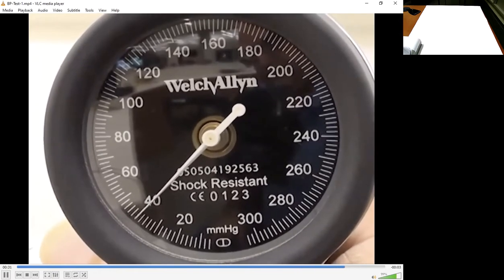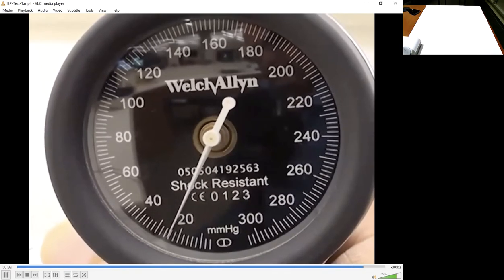All right, so you're going to self-grade yourself, but this is an important reflection. Were you close, within 2 millimeters of mercury, to 84 for the systolic over 66 for the diastolic? So it was 84 over 66. The sound started at 84, went away at 66. Okay, we'll do a couple more practices.